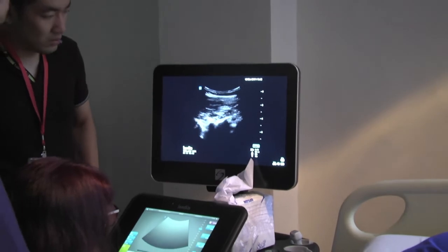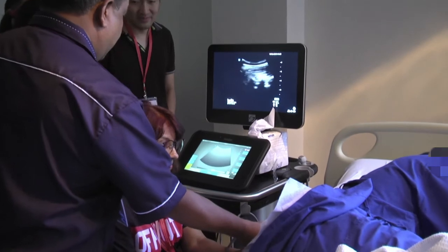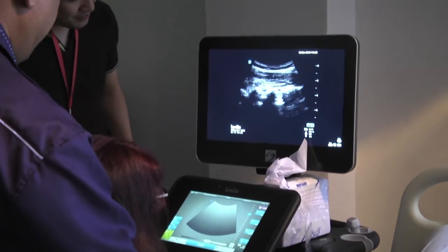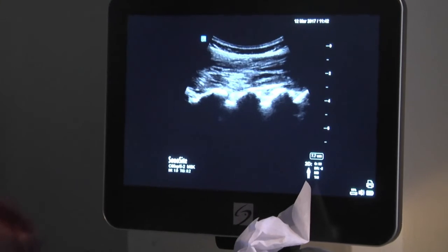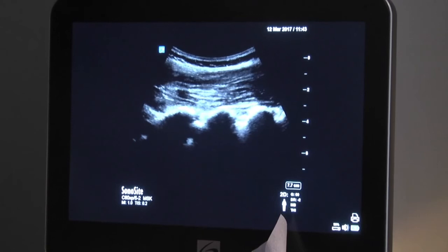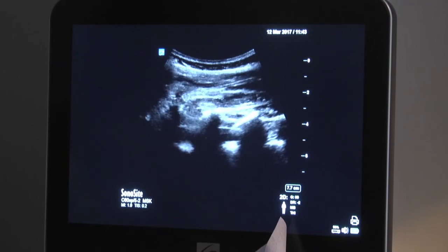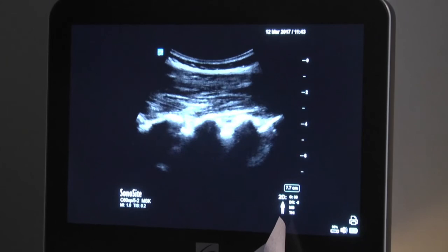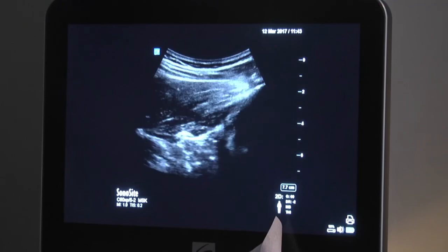Okay? Now, what are we doing? You should start from the sacrum. Okay? Start from the sacrum. We see the lamina of L5, 4, and 3, right? Now we've put the marks on the skin, so this should be your normal thing to do first. See L3, 4, 5, okay? And then in order to see the neuraxis, you have to tilt the probe and slide it a touch. Can you see that? Okay, so L3, 4, 5, and this is the articular process. This is the transverse process.